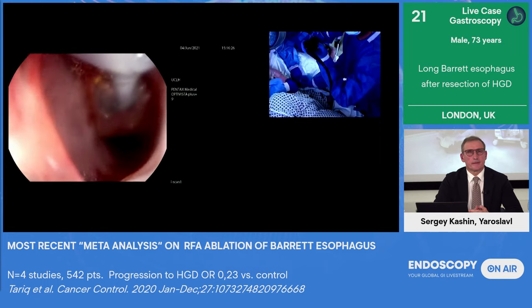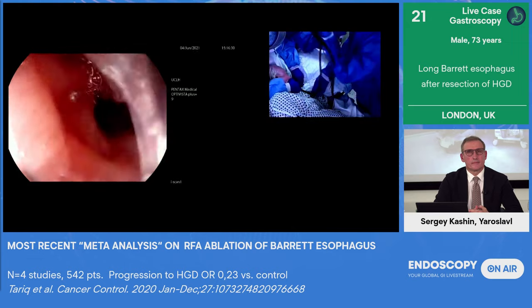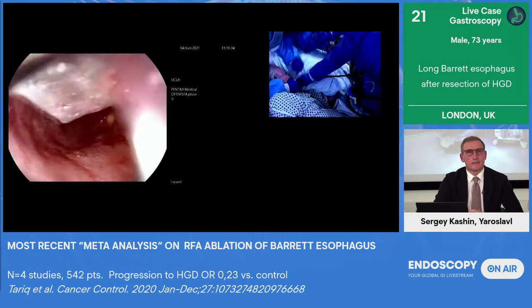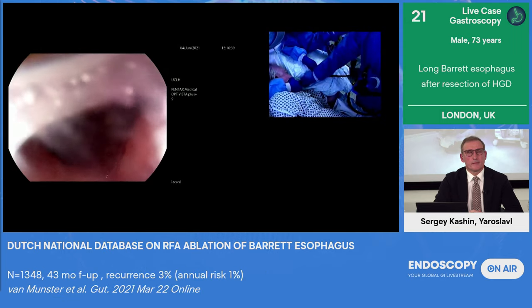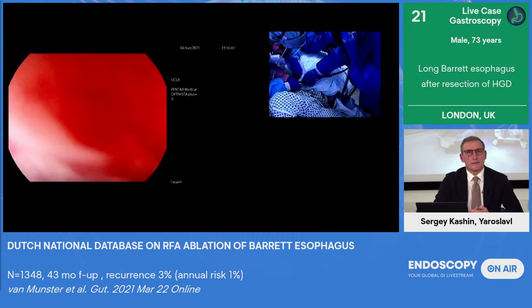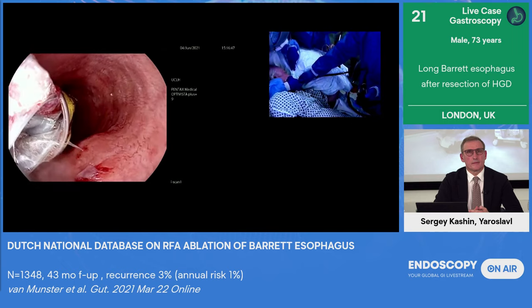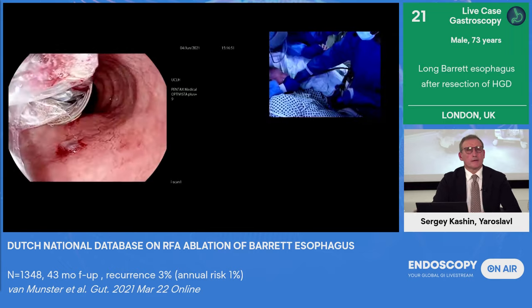So one of the advantages of this device, Sergey, is that you have direct visualization. Vinay's in complete control here of what he's done with the catheter. And we're going to show you just a couple of ablations, if you don't mind. So Vinay's got his scope just sitting above the catheter. He's really elegantly maneuvered some really tricky anatomy here. And you can see the catheter. So Vinay, over to you. What are you going to do now? Now we're going to work from proximal.